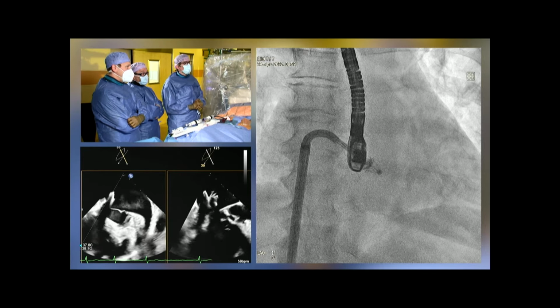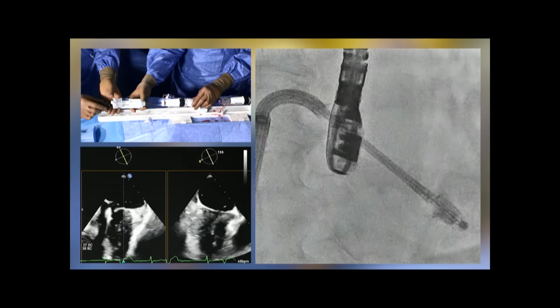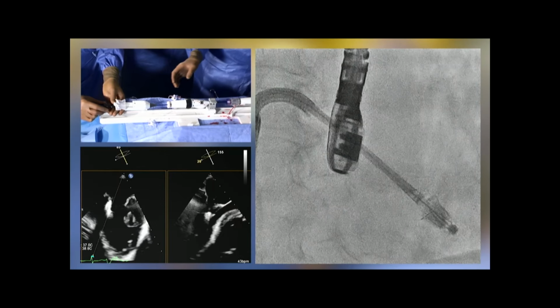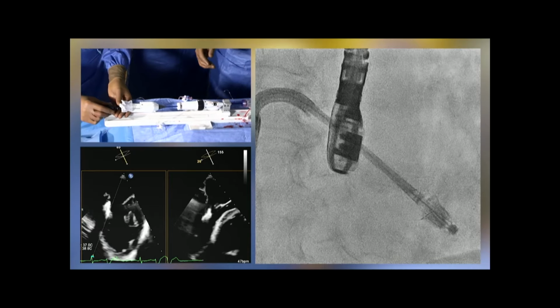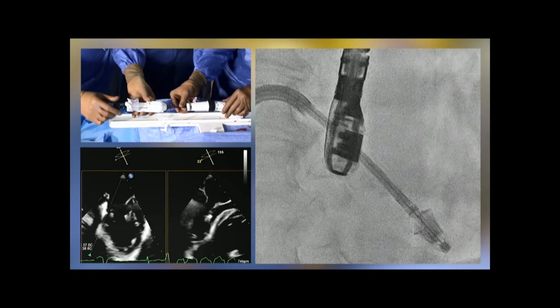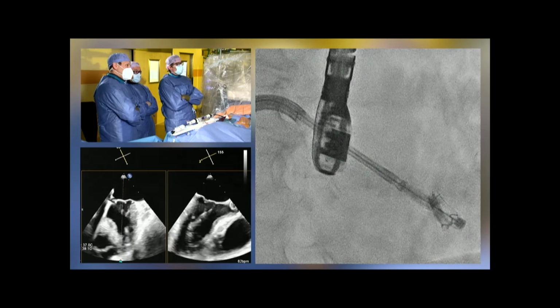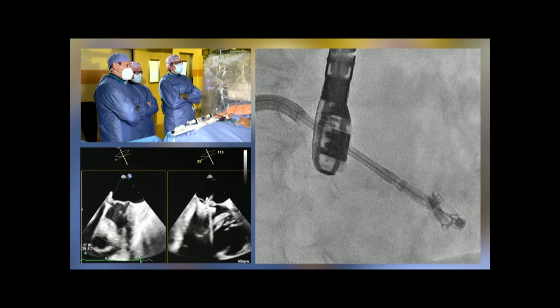Yeah, I totally agree. Okay, we cross the valve. We will double check on fluoro whether we've changed our clocking, maybe a little bit, but that we will see better once we open the device. Let's go to the X-plane view again. We're still in the breath hold. You see, we do have some time, but not endless.